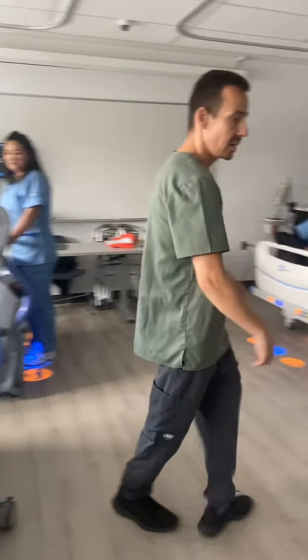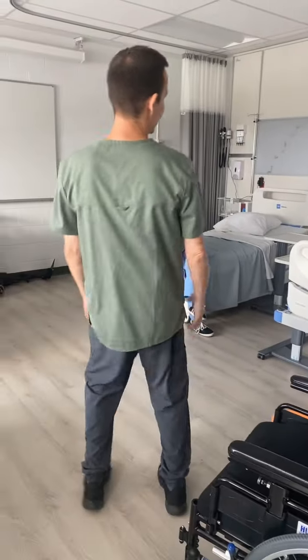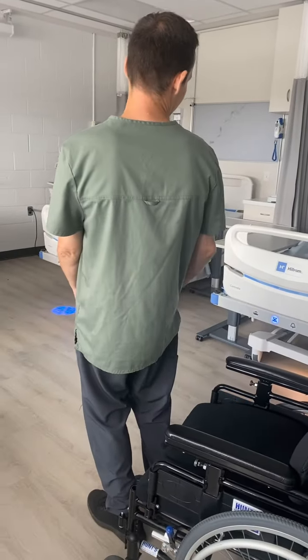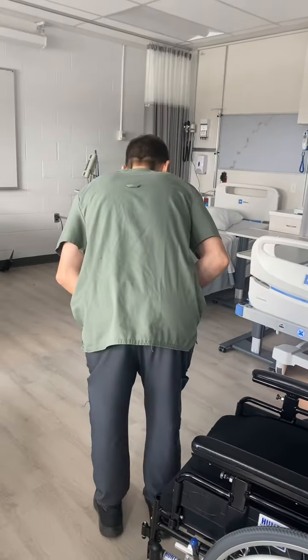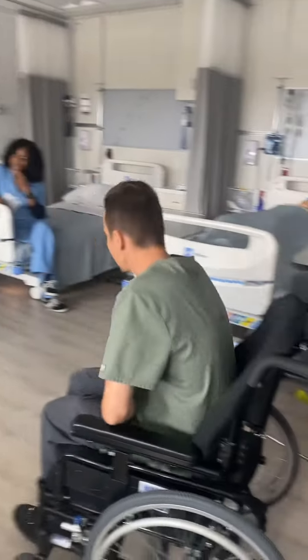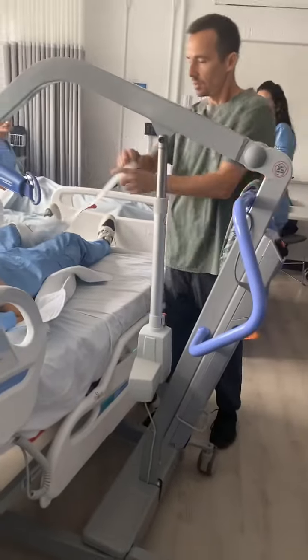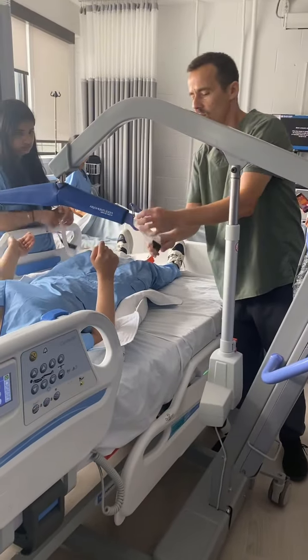Like this chair, if the patient is lying down in the sling, it'll be hard to position them sitting upright. But if they're in the sling already bent, it'll be easier to position them in the chair, right? The way you do that is, for the bottom part, you usually use the longest hooks.